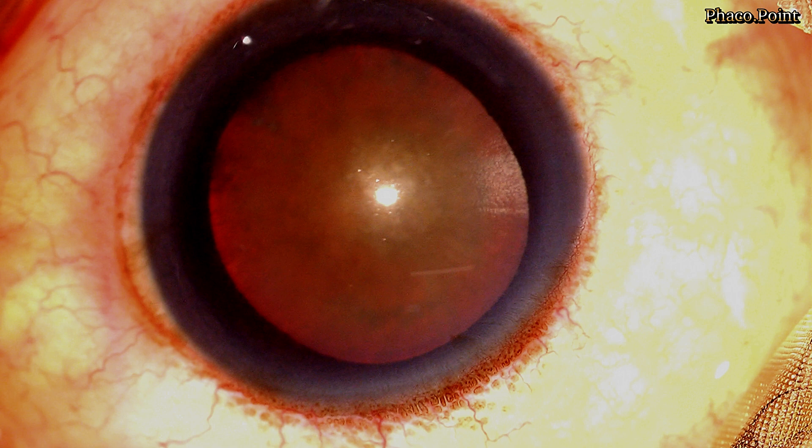This is a patient with a posterior polar cataract with an associated dense nuclear sclerosis. Very often when faced with a dense nuclear sclerosis, it's very difficult to perform the hydrodelineation. The main reason is the fact that you've got a dense nucleus, and therefore burying into it, finding a plane, and then injecting the fluid can be rather challenging.